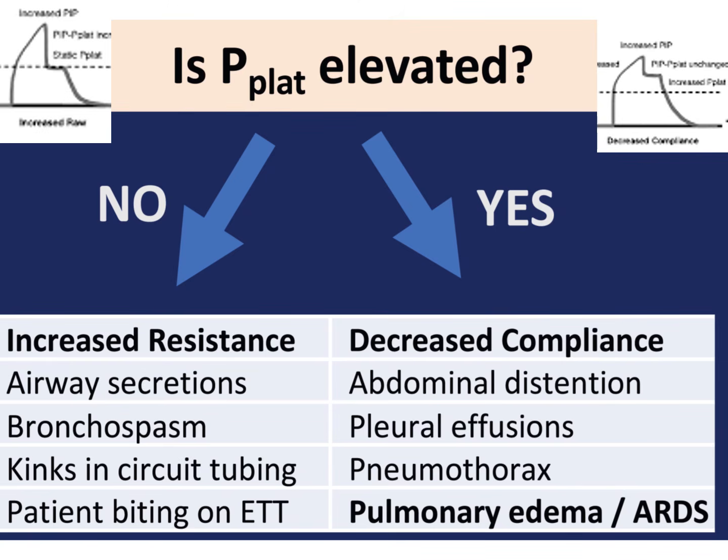If both are up, so the plateau pressure is also up, that's a compliance problem with the lungs, so abdominal distension, pleural effusions, pneumothorax, ARDS, pulmonary edema, pneumonia, that's the sort of thing that does those problems.